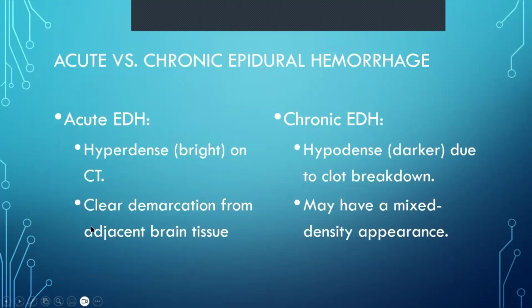Okay, so what we're going to do now is we're also going to answer a question that often comes up with people: how do I know when something is chronic as compared to when something is acute?